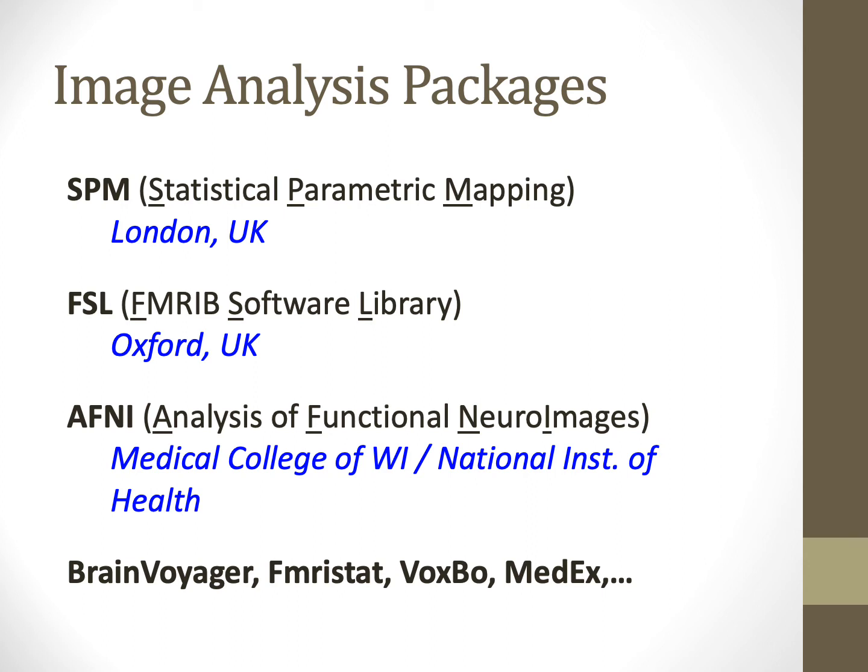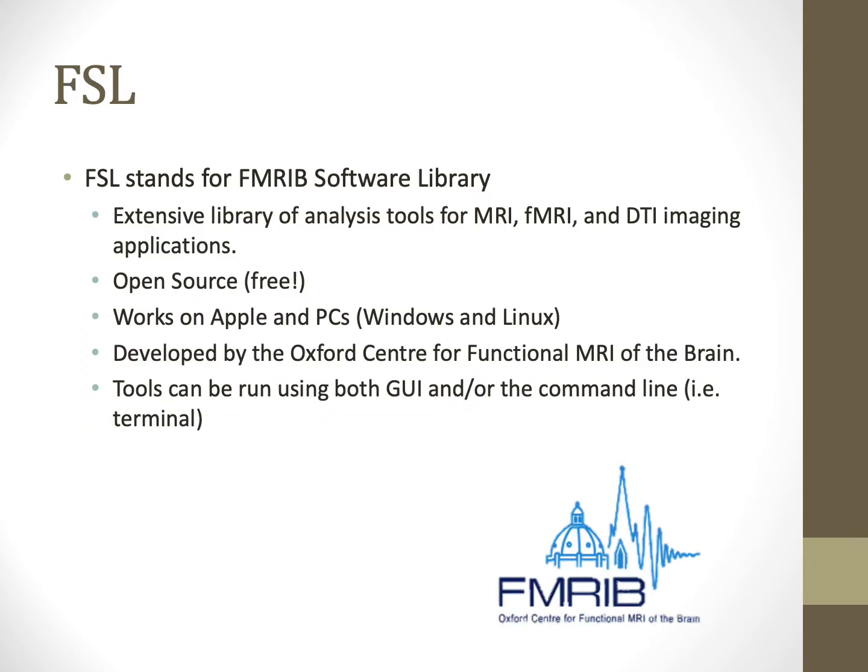We will also introduce other imaging packages that are more focused on specific neuroimaging applications, like the MRtrix package for diffusion brain imaging. Note, while FSL and AFNI are two suites of tools commonly used, these are not the only ones available, and many of the exercises that we perform throughout the labs can also be done with other tools and approaches. So let's introduce you to FSL.